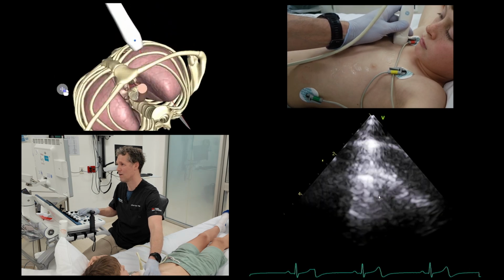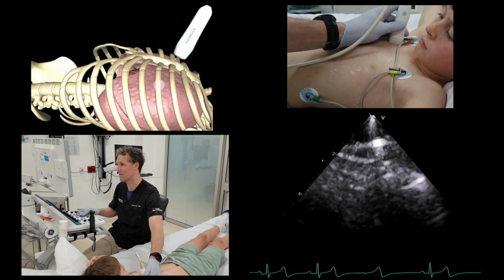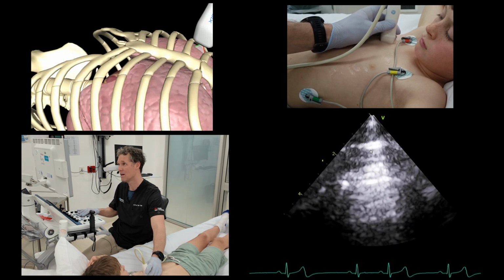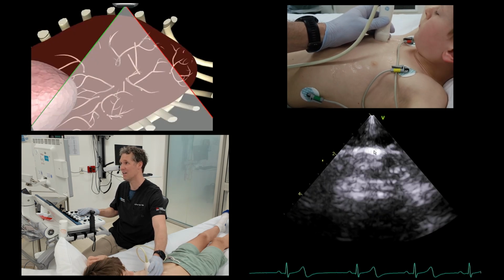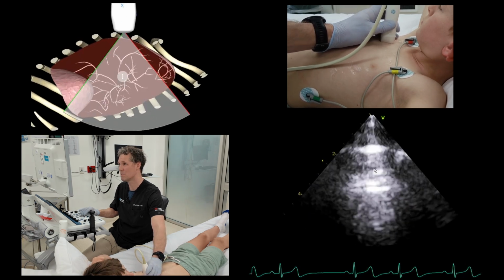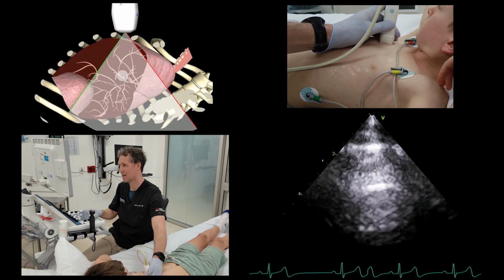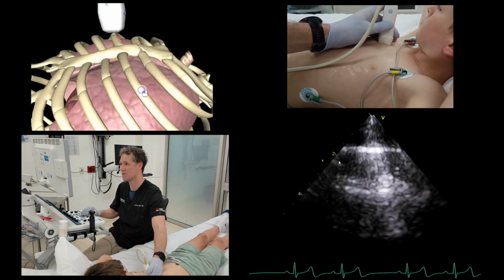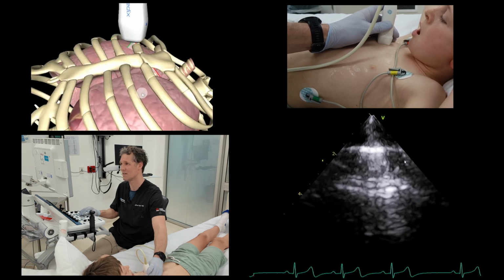And I try and find it where the whole thing goes black, that's a rib. As I slide down, I'll then come to another rib. There it is. So I'm just going to want to be somewhere in between that. And what I'm looking for is this twinkling line at the top between the two ribs. There's the inferior one, there's the anterior, upper one.